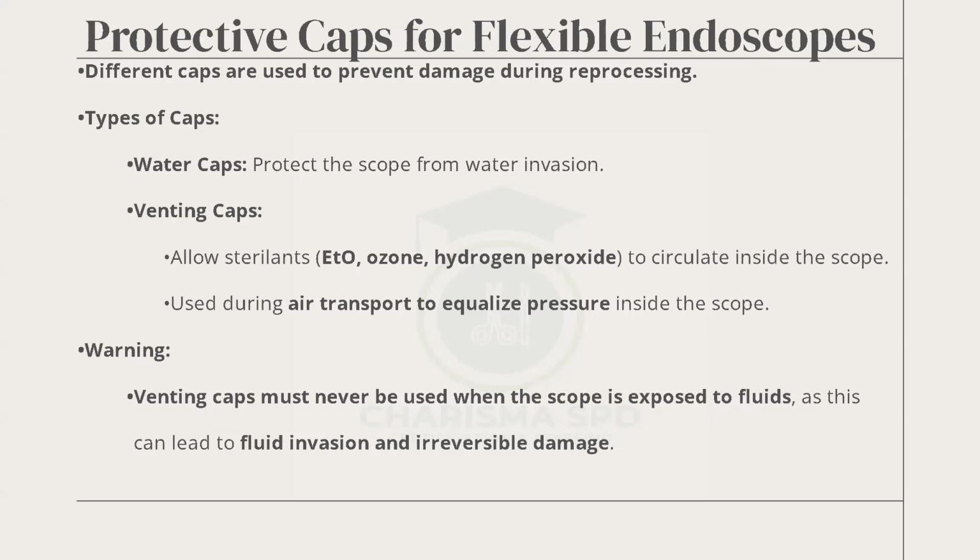So venting caps must never be used when the scope is exposed to fluid. Exactly what I said. Because when you use the venting cap, you're exposing the scope to what? Damage. It's like not wearing a mask and standing in front of somebody who has COVID and saying, cough for me to see. Next slide.